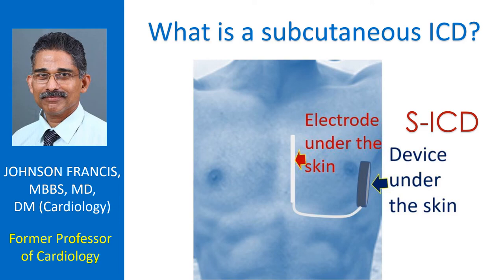ICD stands for implantable cardioverter defibrillator in cardiology. It is a device which monitors the heart rhythm and automatically treats it with electrical signals, which could be a high voltage internal shock if needed. They are also called AICD or automatic implantable cardioverter defibrillators.